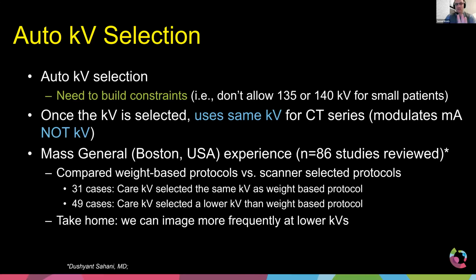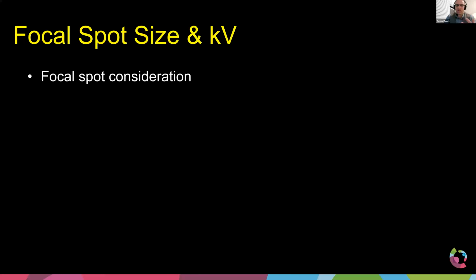If you don't have that technology or you're not comfortable with that technology, then just consider, as an optimization team, you could go back and take a hard look at maybe your chest, abdomen, or pelvis protocols and say, if we're routinely doing everything at 120 kV, is there an actual subpopulation in our patient group that could be imaged at a lower kV, such as smaller patients, thinner patients, patients that, for example, are going to get a CTA or a contrast enhanced image.